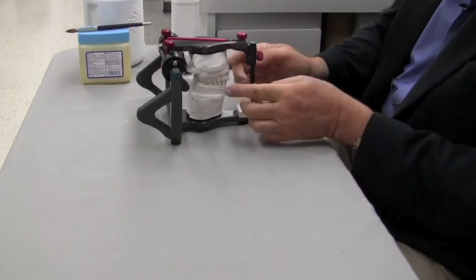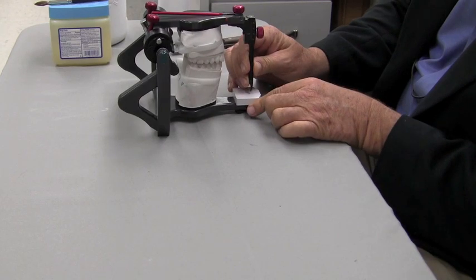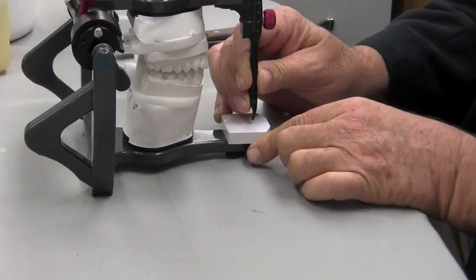That is what anterior guidance is generally, from cuspid to cuspid. So a guide table is nothing more than a representation or a pantograph of how those teeth riding along each other actually move the pin up here on the guide table.